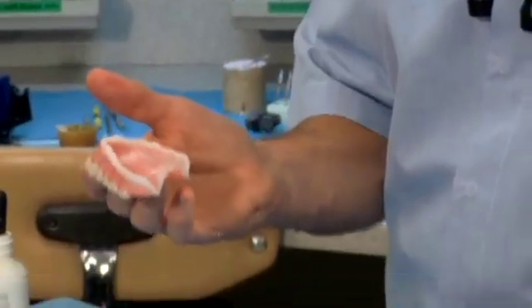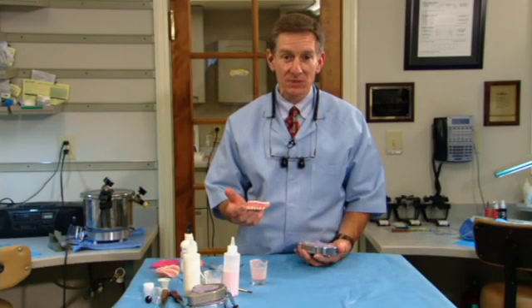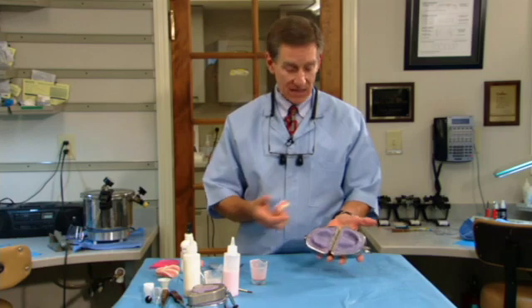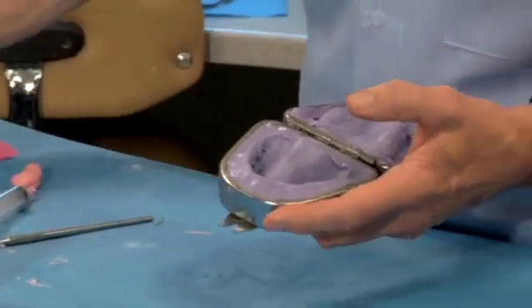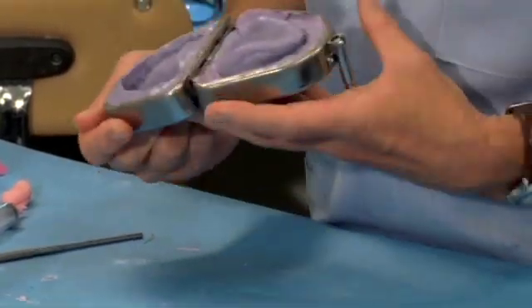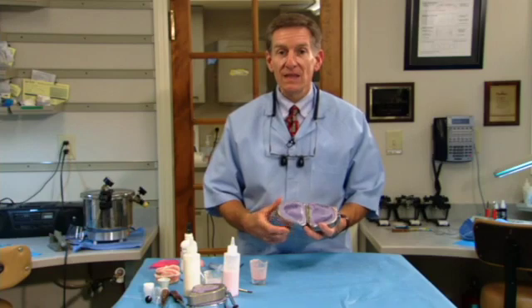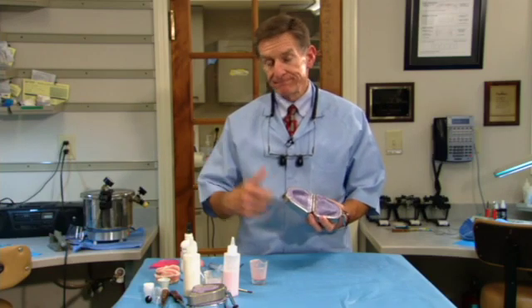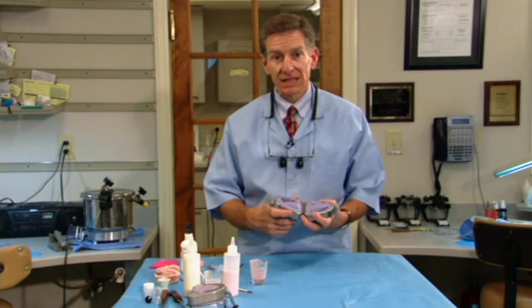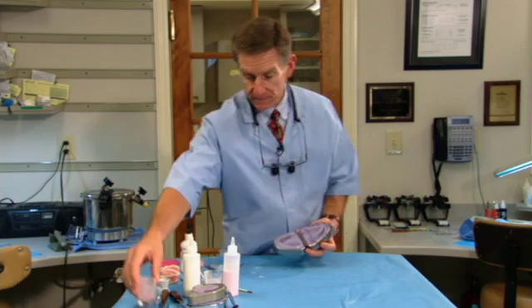So if we need to have a scan guide for a CT scan for implant placement, there it is. We make the scan guide right here. The other thing we can do is we can just mix up clear acrylic, close it down, no spacer, no nothing, and then use that as a guide for our implant placements based on a radiograph and the shape of the ridge. Let me show you exactly how it works.